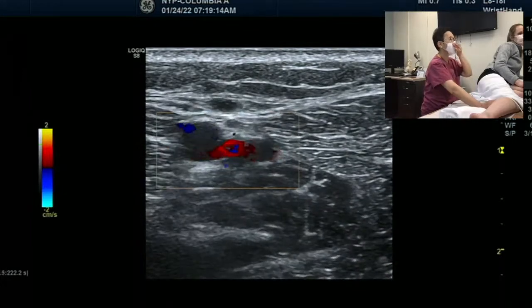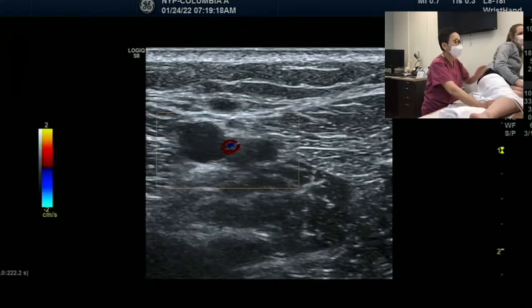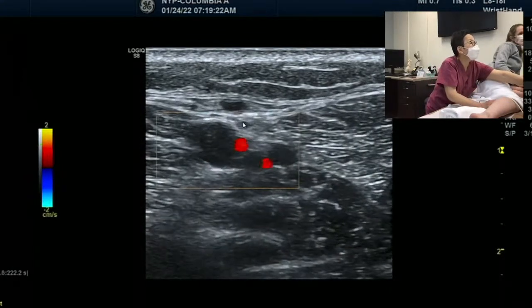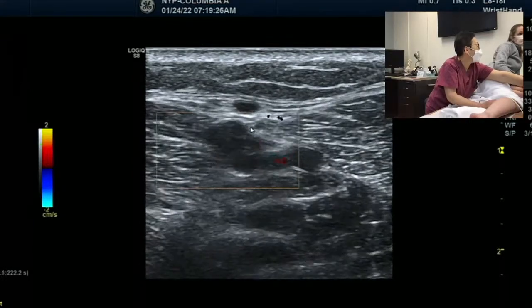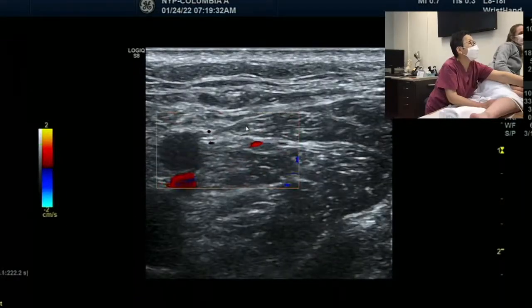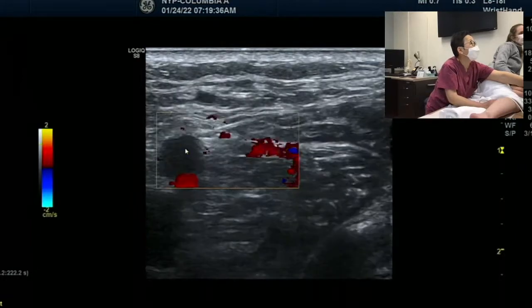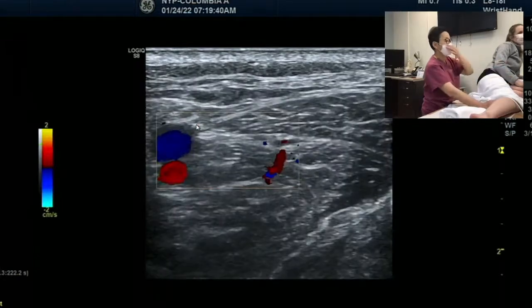Become popliteal artery. So just between that, cursor, this should be the medial sural cutaneous nerve, and then it's gonna be the tibial nerve. See now, only one artery, do you see? You remember this one? Only one artery we see. And then the tibial nerve sits over there. Okay. God bless us this morning.